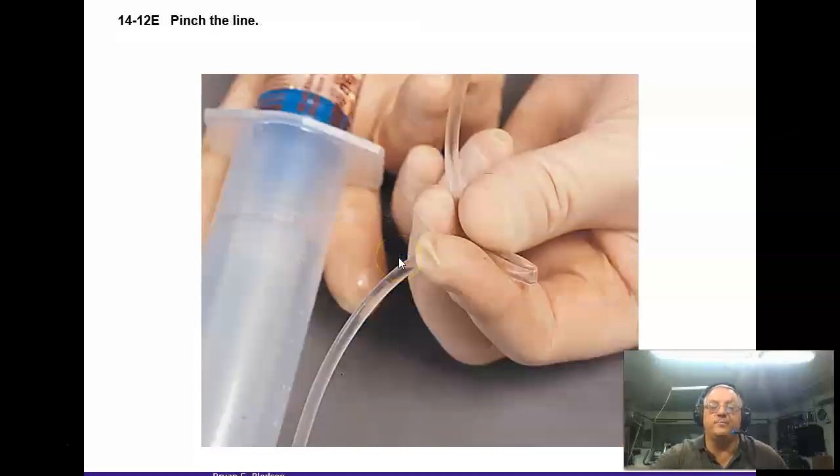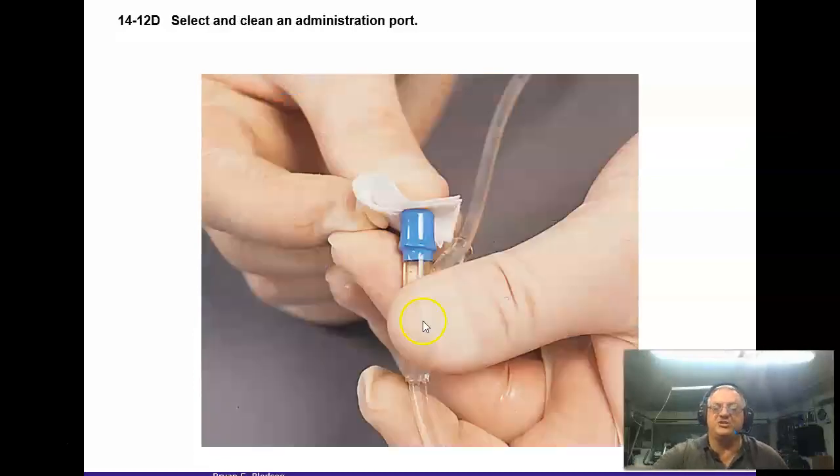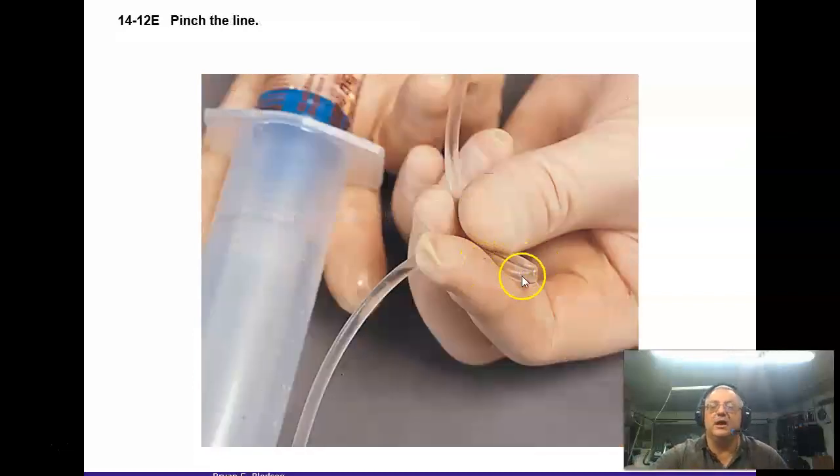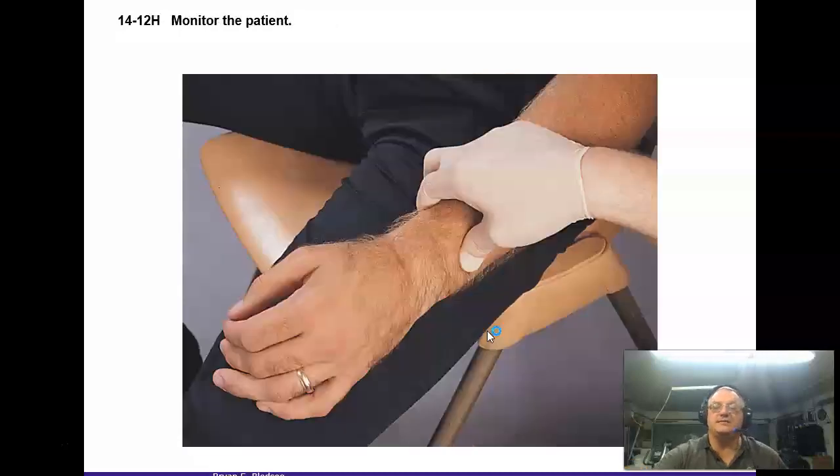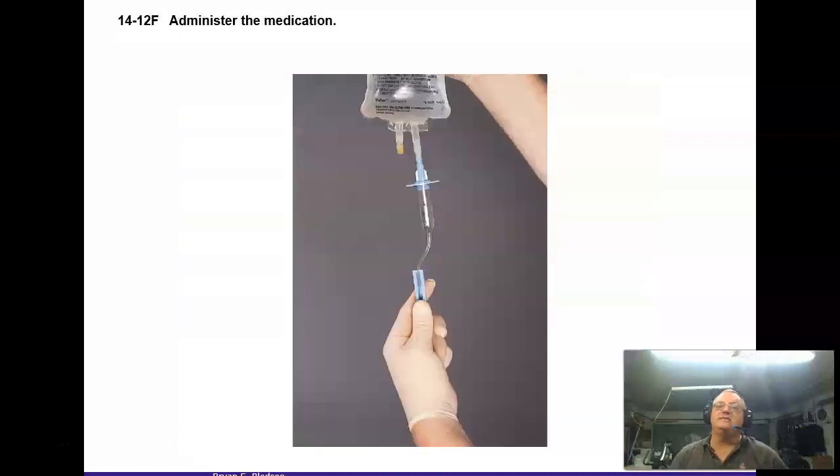Clean off your injection port. Matter of fact, Shands actually uses these little green caps that go into these, and they help reduce the infection rates. They work pretty good, actually. So when you're doing that, you're going to pinch off your IV line, and then you're going to administer the medicine. After you administer the medicine, you're going to flow some fluids through that to flush it through. If we don't have a running IV, then you want to give at least one flush, probably even two flushes to get that through. One flush for a standard med is usually fine.